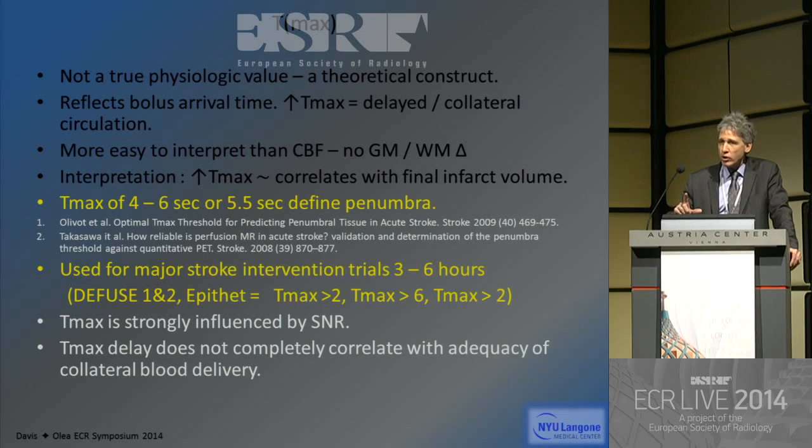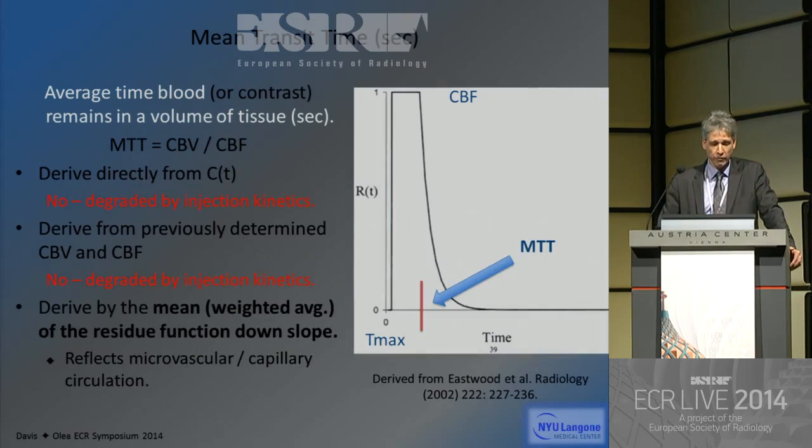Tmax is strongly influenced by signal to noise. Depending upon how good your study is, that's going to influence what your Tmax comes back as. And the problem is that Tmax is a theoretical construct. Again, just because you have delayed flow doesn't necessarily mean that you're going to infarct.